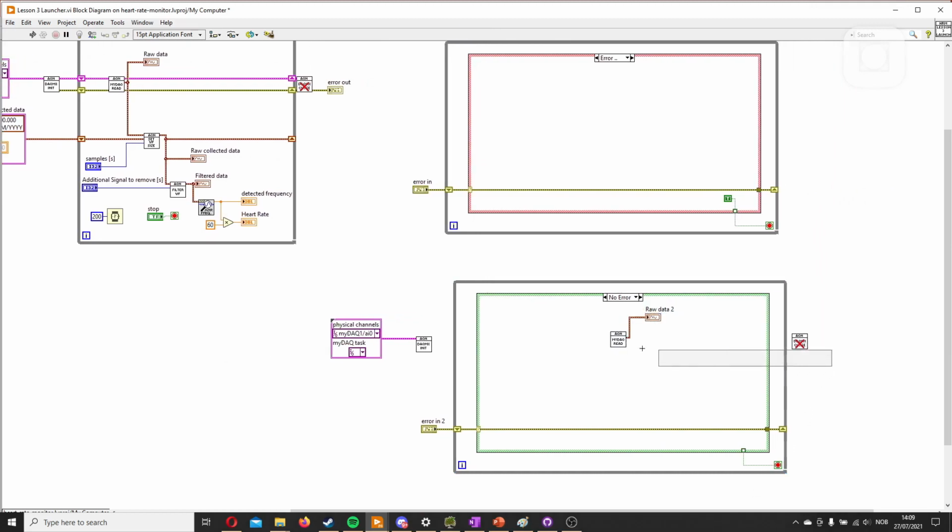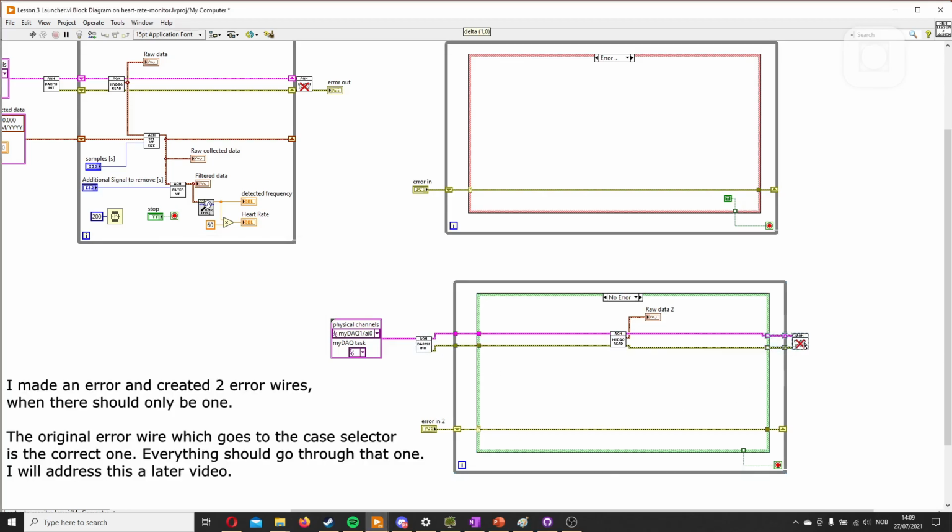And then we can hook it up. Just mark everything, hold Control, and while holding Control, press space first and then W, and they will auto hook up. And we can add shift registers. We also need to connect it on the backside.